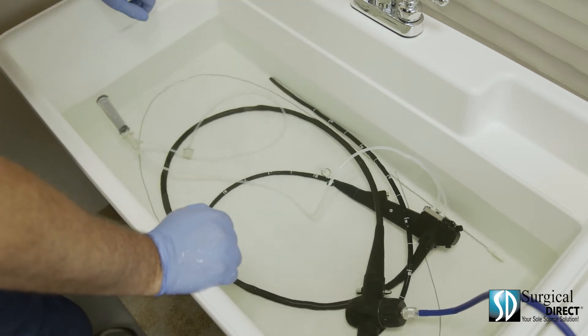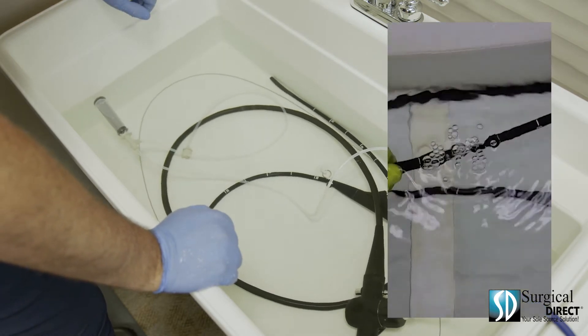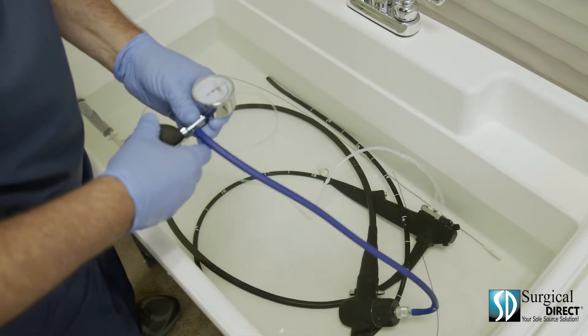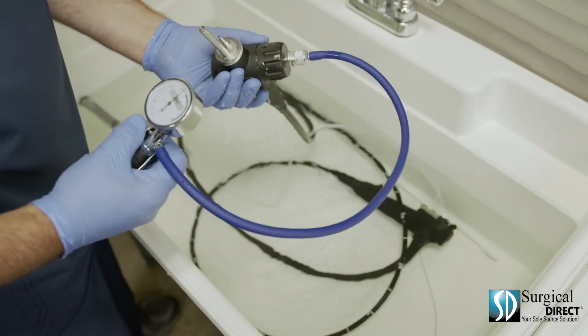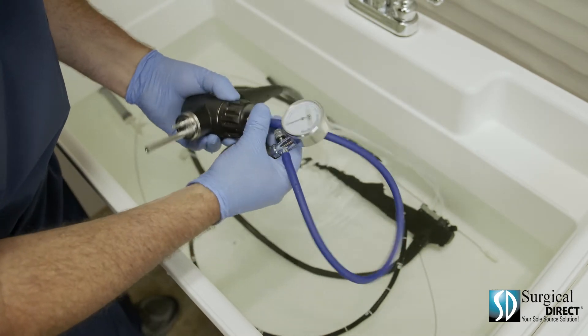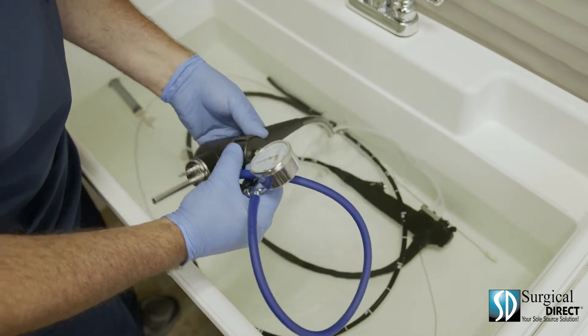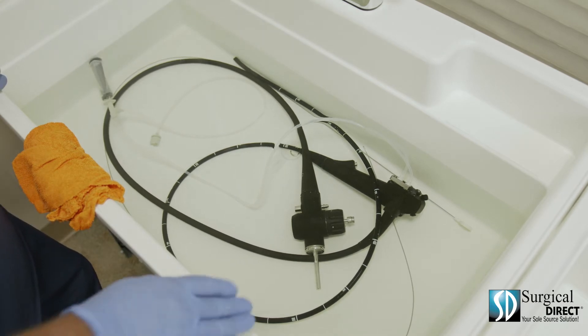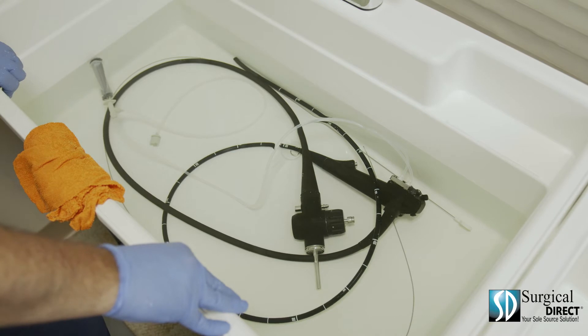Check the scope carefully for any leaks. Most leaks will look like champagne bubbles; others may be even more prominent. At this point, we're sure there's no leaks. Remove the video hub from the water and release the pressure from the scope. Disconnect the leak tester from the soaking cap, double check that the cap is tight, and resubmerge it. Now follow your manufacturer's instructions and add the appropriate amount of enzymatic cleaner to the water. It's important to not add the enzymatic cleaner before leak testing, as most enzymatic cleaners can add bubbles to the water which would give you a false positive.